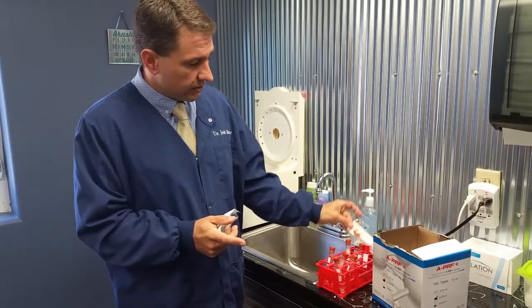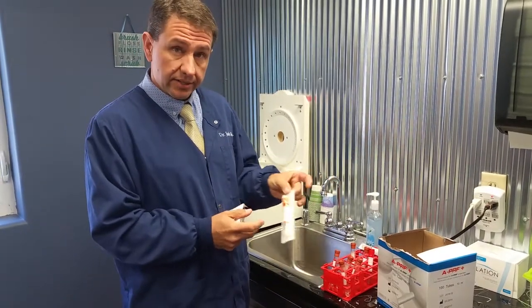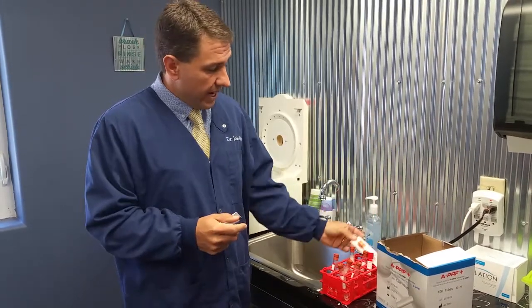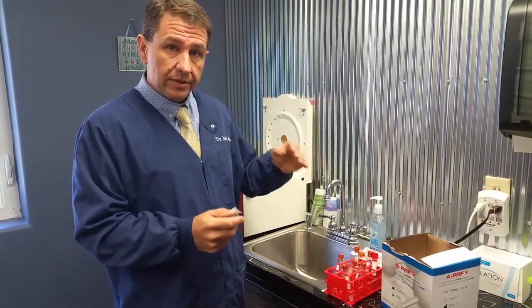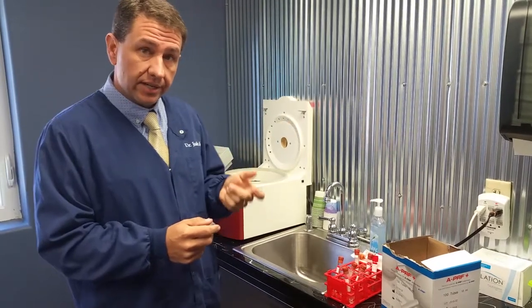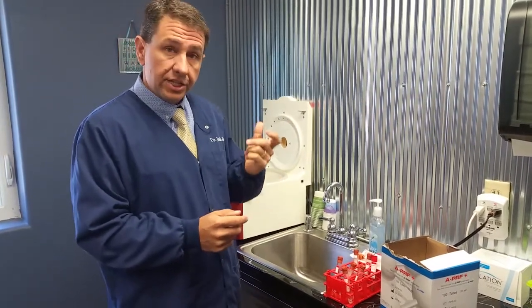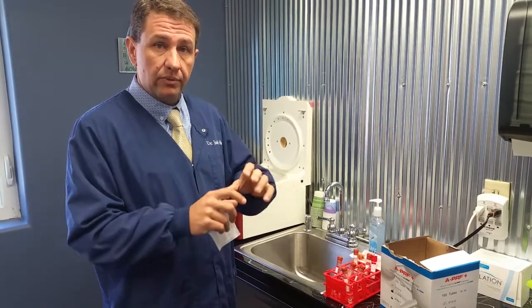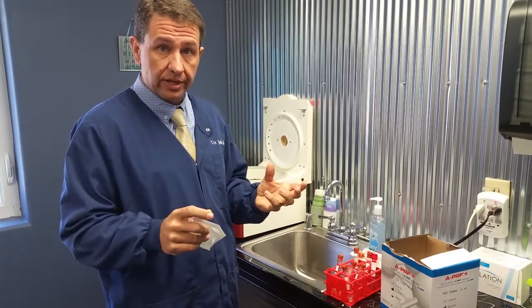If it doesn't have the silicone coating on the tube, then it doesn't start the cascade, and it'll stay mixed in with the media. So as you spin it at that rate, the fibrin is still in solution, and you can suction it out and then inject it back in, at which time over 20 minutes or so it will harden and form the layer that you're looking for.